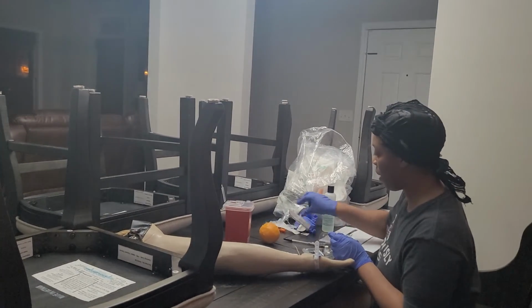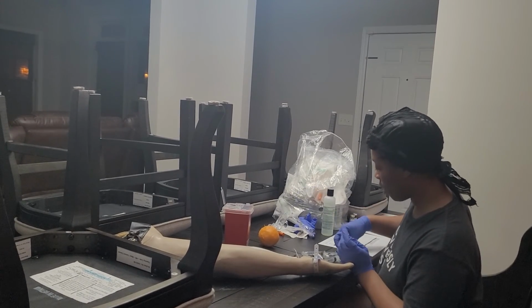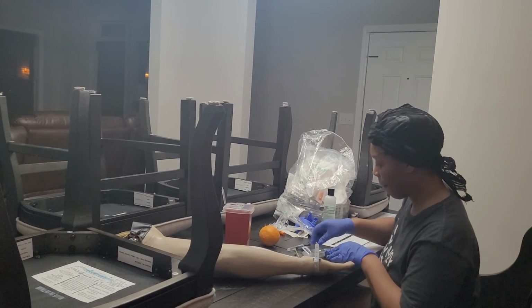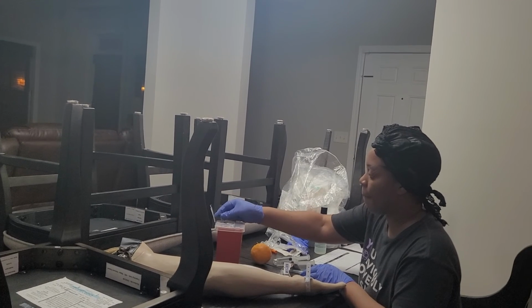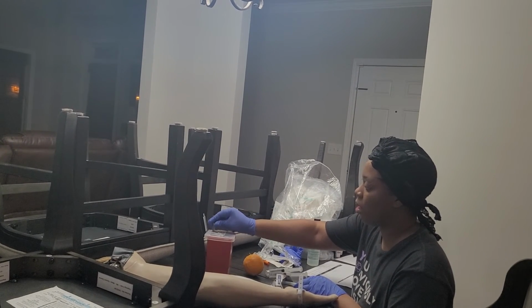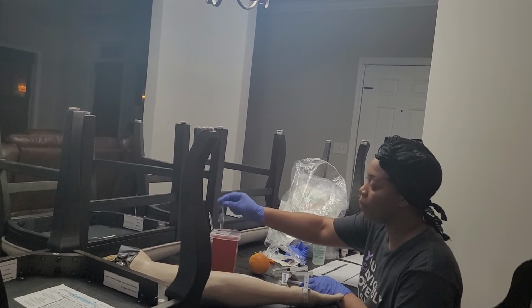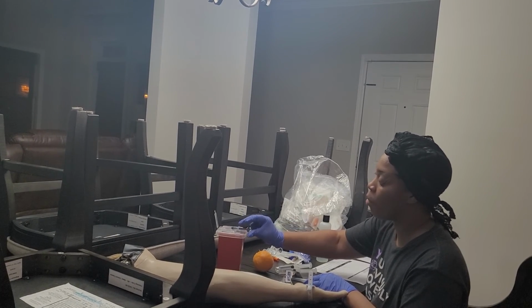And I'm going to clean up my mess. I'm making sure that Mrs. Larson is in a comfortable position. And I'm going to start discarding the needle and the syringe in the sharps container, but for the purpose of the video, I need to pour out some stuff.